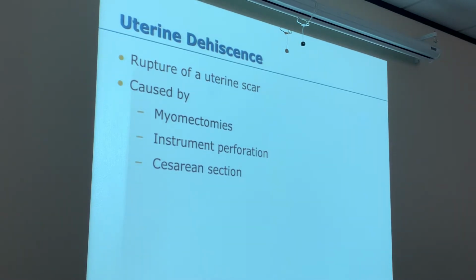It can adhere to my bladder, and if I give birth and it comes off, what's going to happen? It's going to rupture my bladder. So it's important that we take a good medical history on our OB patients, because if they have had a C-section, we want to be sure to look at that area very well as far as the placenta is concerned, with color, because that's the only way we can make that diagnosis.